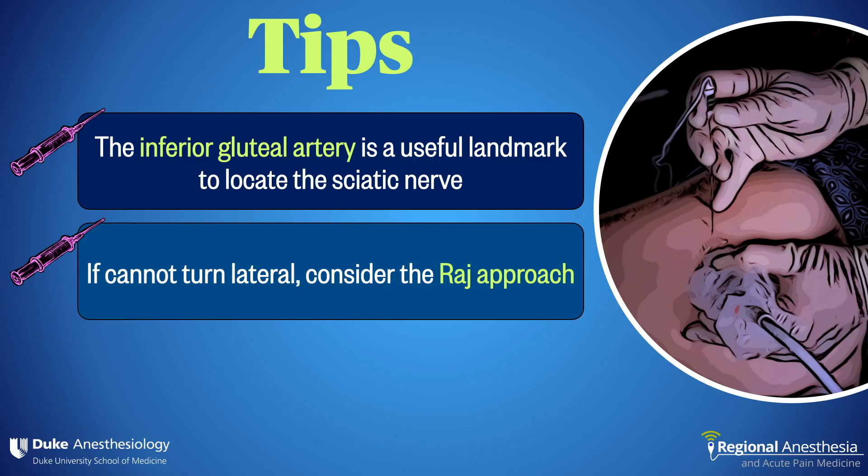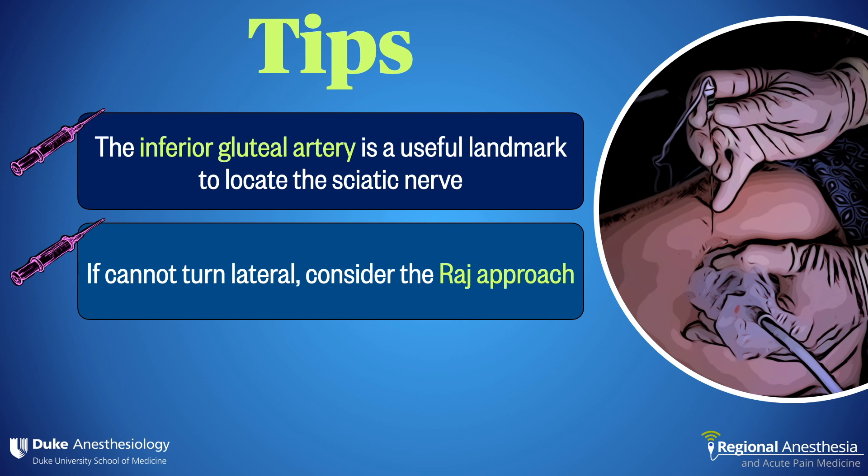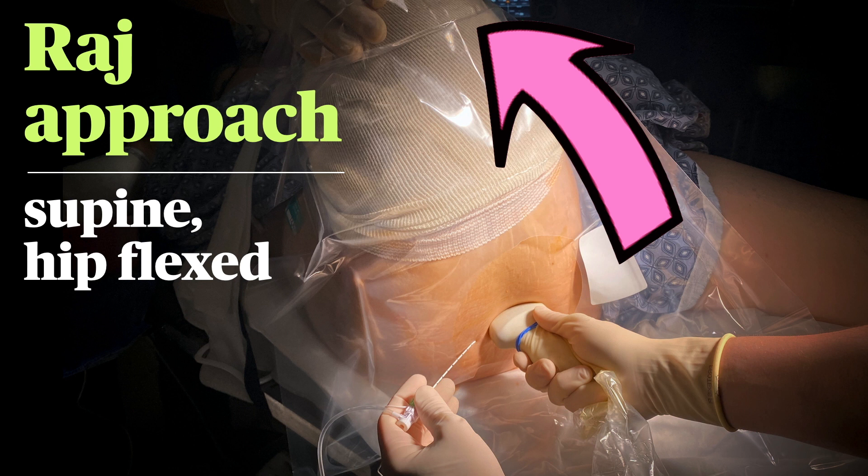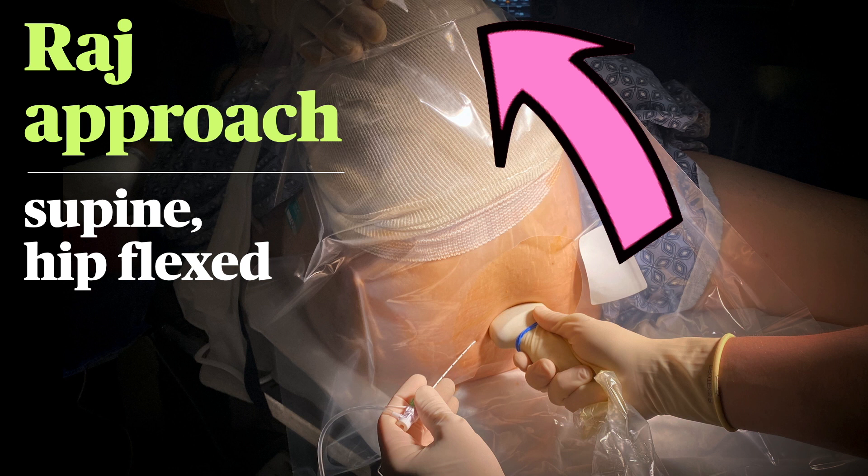Second, turning the patient lateral can sometimes be inconvenient or uncomfortable. In these cases, don't forget about the Raj approach. The patient remains supine and the hip is flexed. You often need an assistant to hold the leg in the air while the operator palpates for the same two bony landmarks and performs a block while seated.